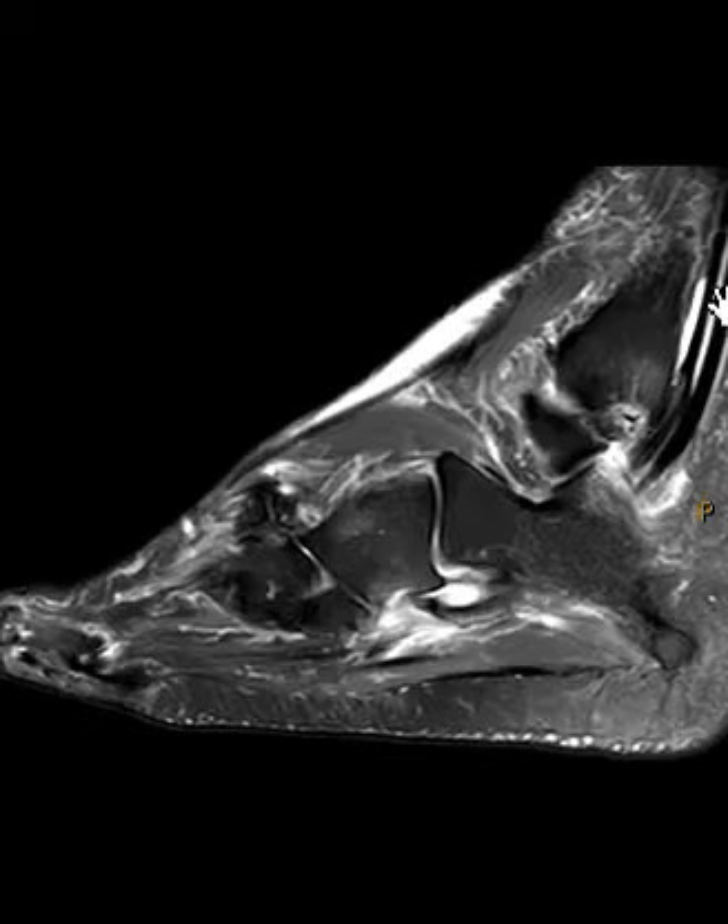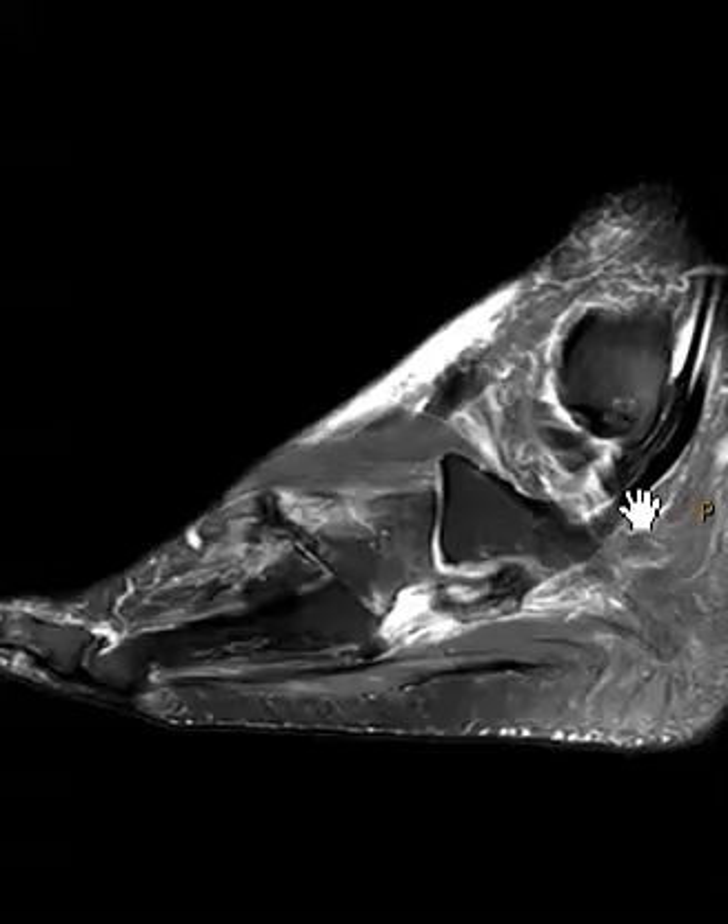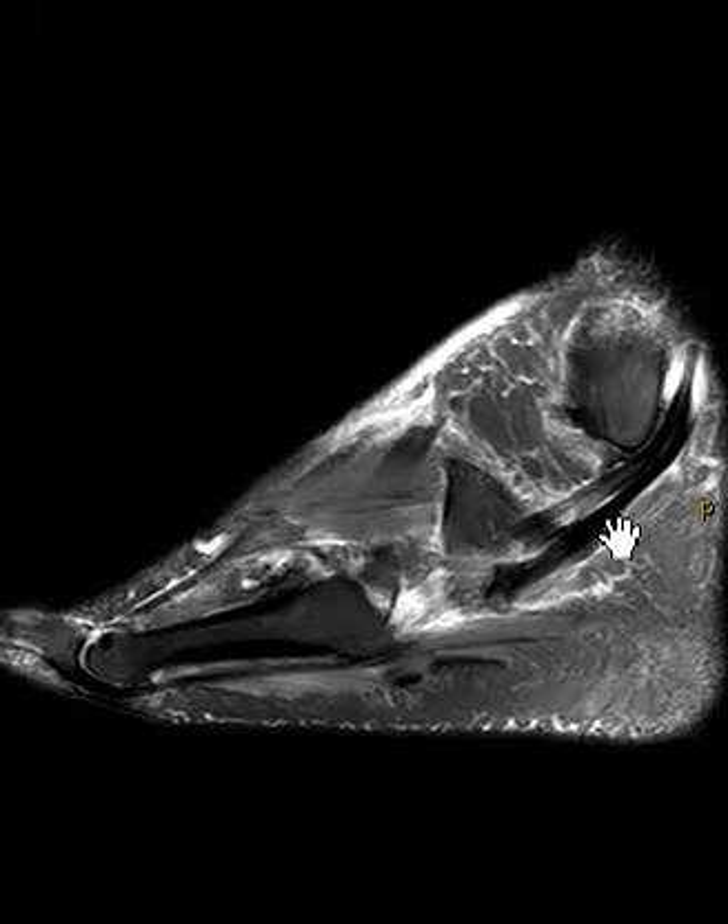Now the peroneus longus tendon comes down around here. It looks pretty good in what we call the supramalleolar portion, above the ankle joint. And then here in the juxtamalleolar portion, right adjacent to the joint, it looks pretty dark, black and good. Now here's the inframalleolar portion that's going to come down along the lateral side. In here it looks a little funny — a little thicker here, a little thinner here, a little bit thicker here — so not quite normal.